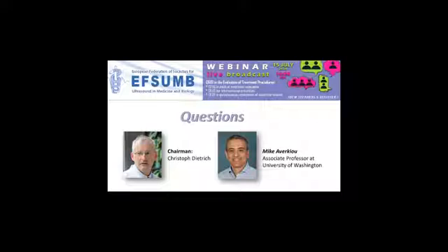We can take care of all motion because now we have the complete tumor, and we should be able to give to the clinician, whether that's first the radiologist and then the oncologist or hepatologist, a very simple answer whether somebody is or is not responding, not only at the end of all chemotherapy sessions, but ideally we would like to do this early on in the first 1 or 2 sessions.